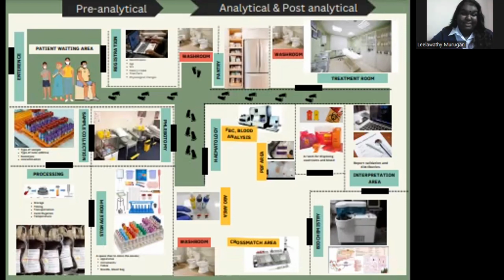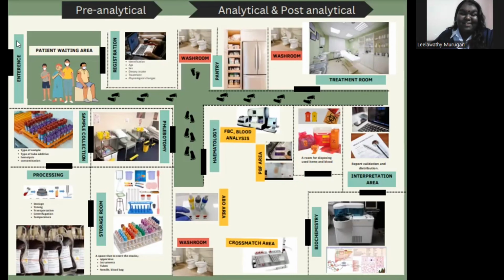Me and my partner Prasad have come up with an interesting idea to set up a lab in a house. So basically, we have designed a hematological lab workflow in order to diagnose anemia related disease. So let's get started. I'll be taking the honor to explain about our workflow in the hematology lab to diagnose anemia related disease. So basically, this black mark indicates a door.